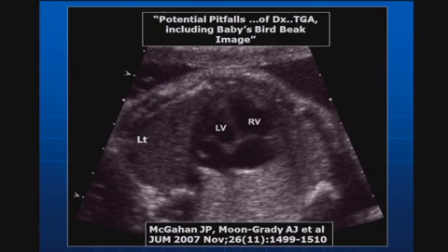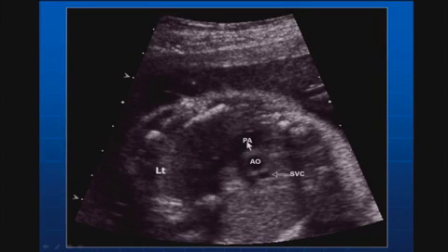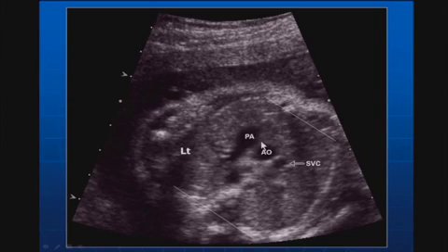So if we look here, we see a normal 4-chamber. That would be our second view. We actually see a 5-chamber, and in that, we're going to see the right ventricle outflow tract and the left ventricle outflow tract across. We go up one, and that thing from the right is going to come over to the left. The aorta is underneath there. It's the midline, and this is the superior vena cava. And this is what it looks like on a higher view, and there's one other higher view that I'll show you: pulmonary artery, aorta, and SVC.